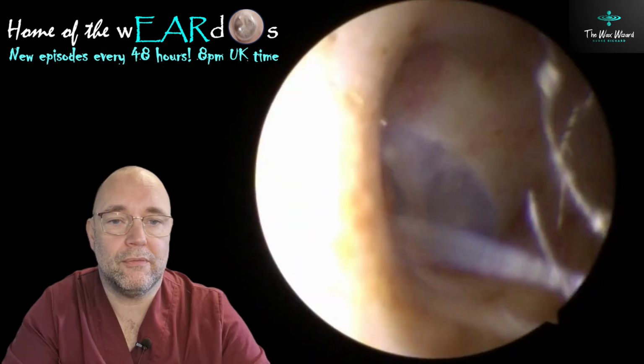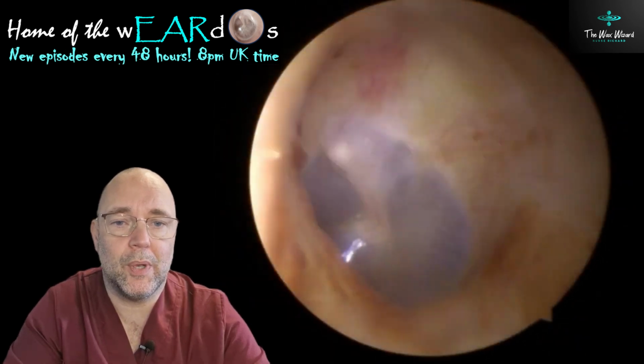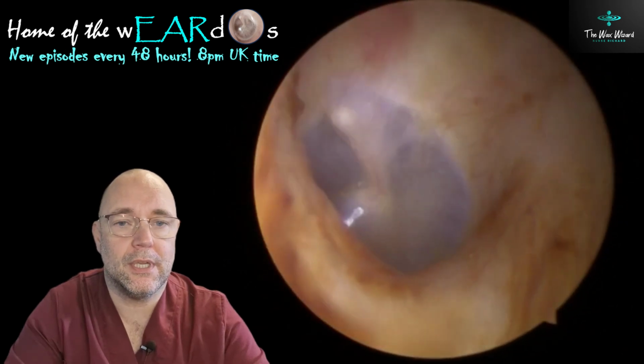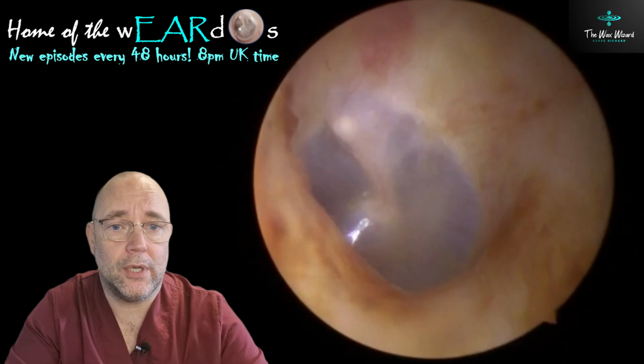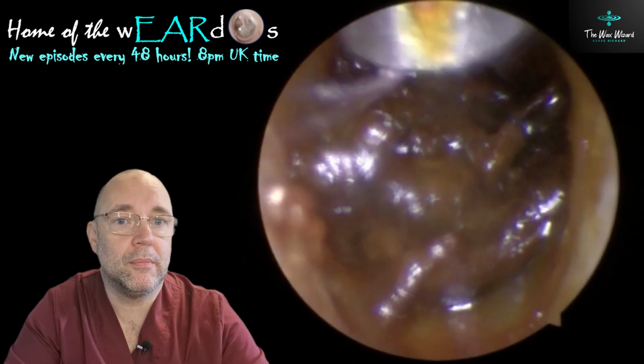It came out a lot more straightforward than I was thinking it would be, that one. Doesn't look too bad at all. Eardrum's looking okay. Next one a bit trickier because it left a little bit stuck on the drum, as you'll see shortly.